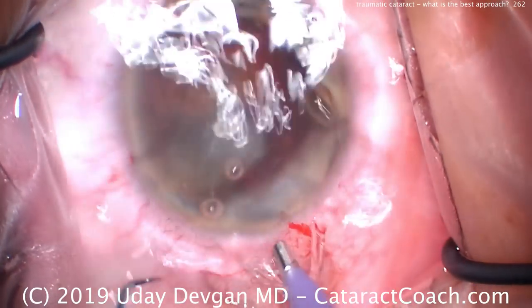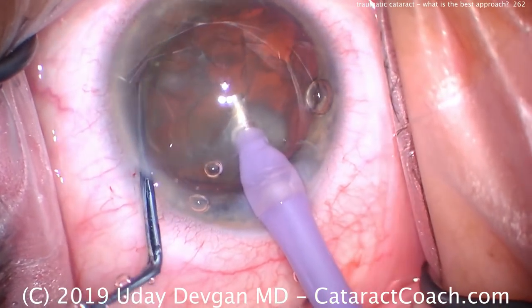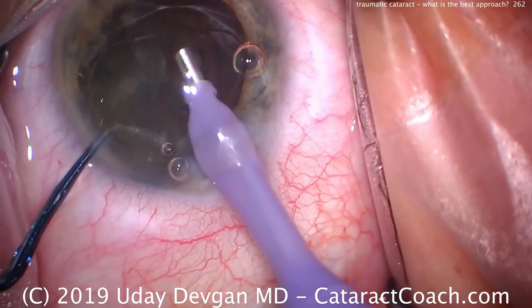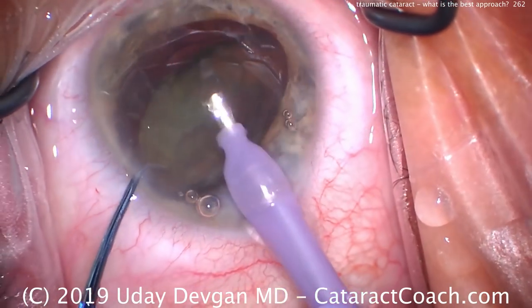That's using Viscoat. We'll go inside here with the phaco probe and just take our time, buzz into this thing, try to break it up into pieces, emulsify it. I don't want to be in the capsular bag here. So again, it's not a very dense nucleus. I'm just going to show you the video unedited so you can just get the full feeling. So the whole case here is unedited today.